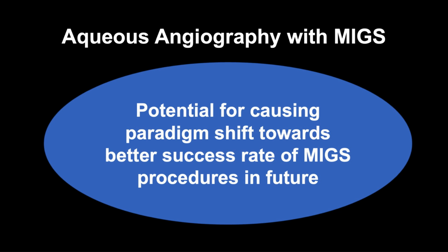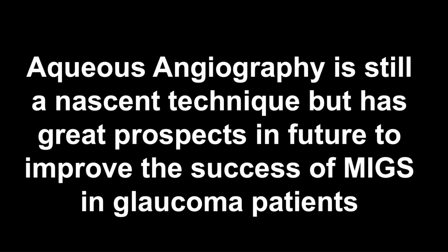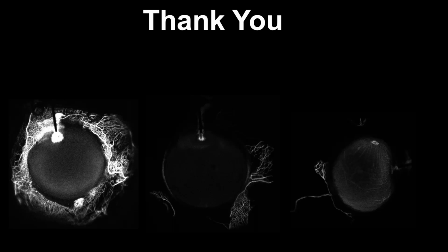Aqueous angiography with minimally invasive glaucoma surgeries has the potential for causing a paradigm shift towards better success rate of MIGS procedures in future. Our take-home message is aqueous angiography is still a nascent technique but has great prospects in future to improve the success of MIGS in glaucoma patients.